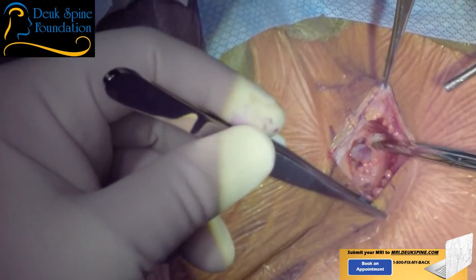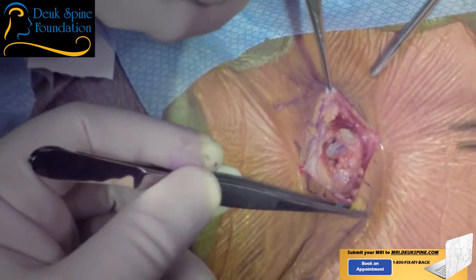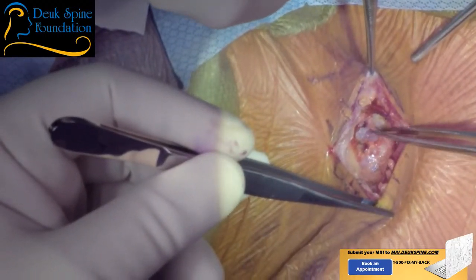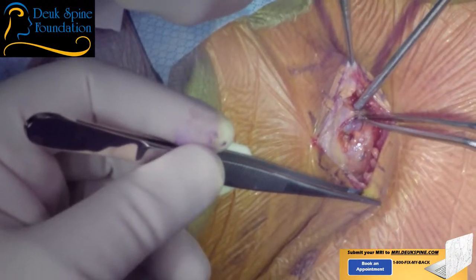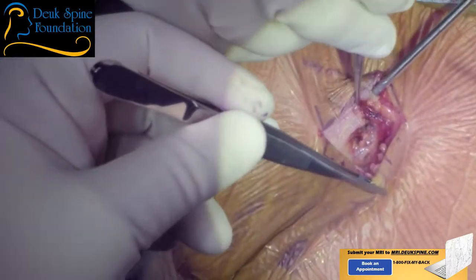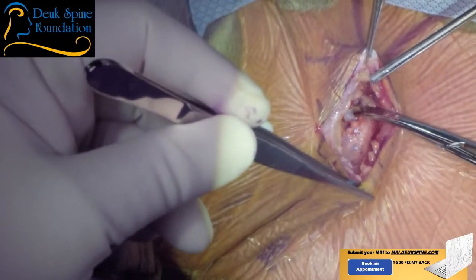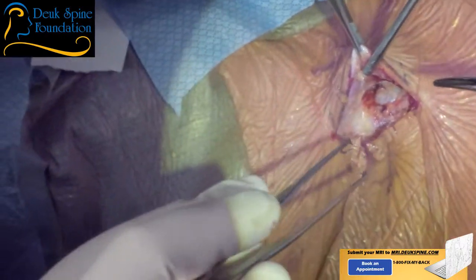We've been doing spinal fusions here at the Surgery Center Vieira in Melbourne, Florida for six years. And an anterior cervical discectomy and fusion is, of all the fusion surgeries of the spine we do, on the back, lower back, neck, thoracic, one of the more straightforward types of surgery.